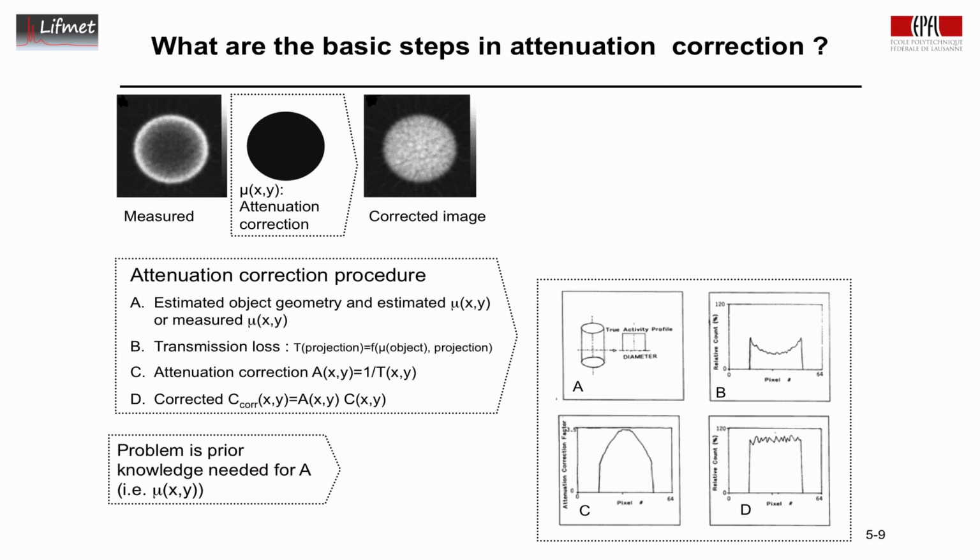However, there is a practical problem here, and that is we need to know the distribution of the linear attenuation coefficient in our subject, in our organs.